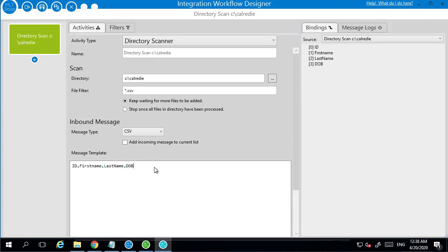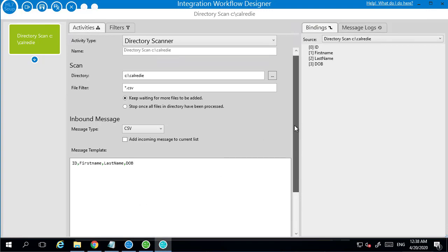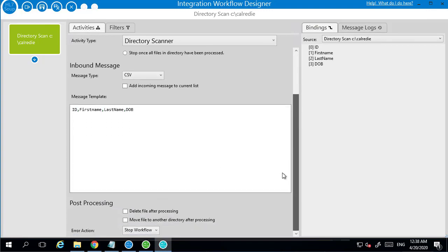Now that one just happened to be a comma separated field, so I'm just going to put in those. For CSV it's just easier to put in some headers to fill in the places. But if you had XML or JSON, you'd actually put the full message that you have into this message template. Finally after it's processed, we're just going to delete that file.